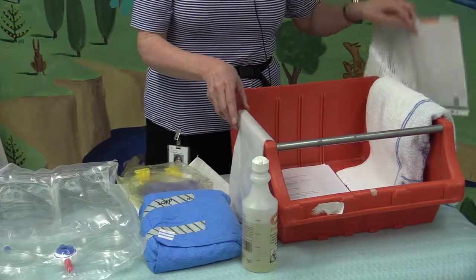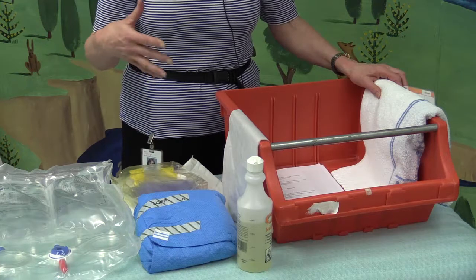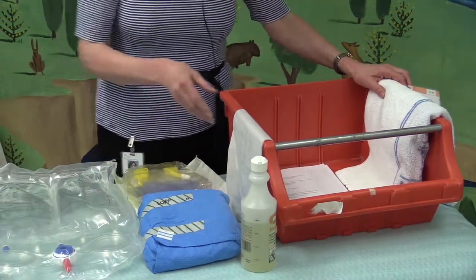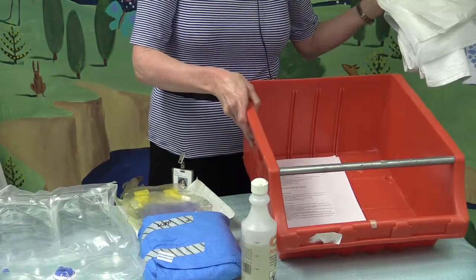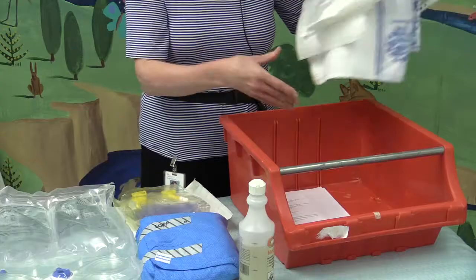And then we need somewhere to put the drain bag so that we don't have dust or bacteria backtracking into the circuit. So that can either be a clean plastic bag, a towel, or a container of some kind that's been cleaned prior to setting up your equipment.